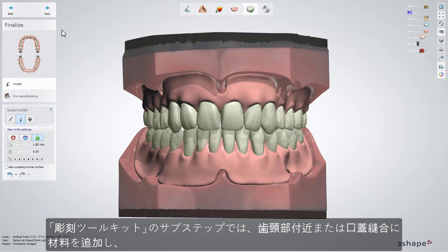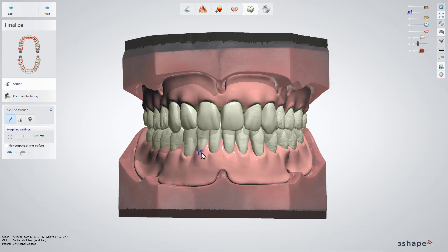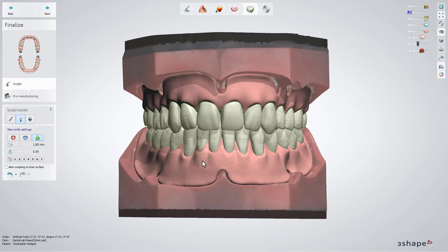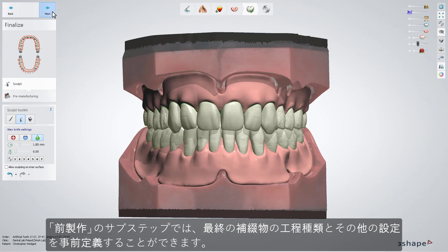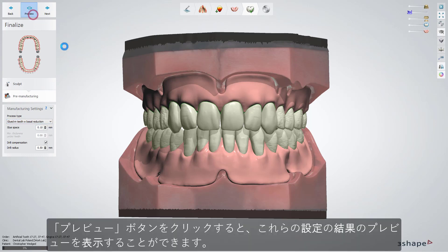At the Sculpt Toolkit sub-step, you can add more material near the cervical area or on the palatal suture, and smooth the surface. In the Pre-Manufacturing sub-step, you can pre-define the process type and other settings for the final restoration. You can also preview these settings by clicking the Preview button.